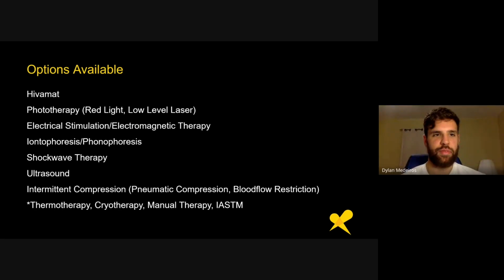Yeah, I remember the first time I was ever exposed to the HIVAMAT and shockwave therapy was down in Houston. That was pretty cool to get some exposure working down there with you guys. The HIVAMAT was always interesting to me because you always had to glove up and use the powder as, what's the term? Like you use the ultrasound gel, you know what I mean? Transduction. As a transducer. Yeah, that was really cool. But like you said, a lot of different options.